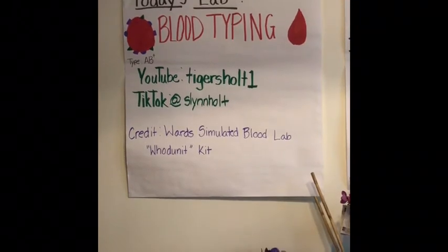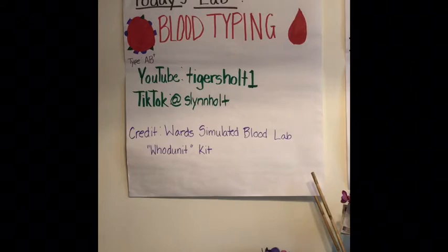Hey everyone, today is March 18th, 2020, and today's lab that we're going to be doing at home is blood typing.